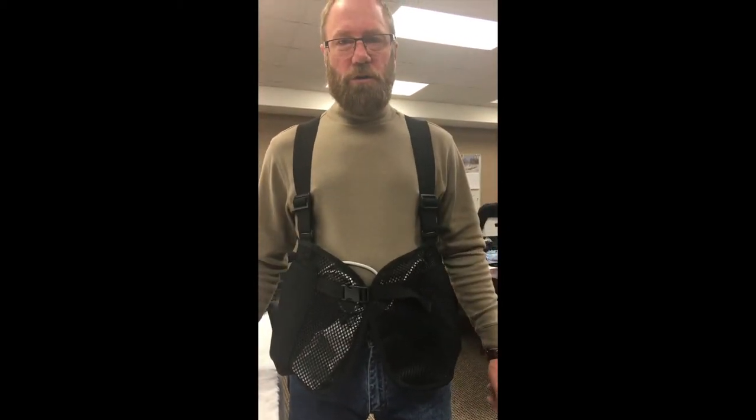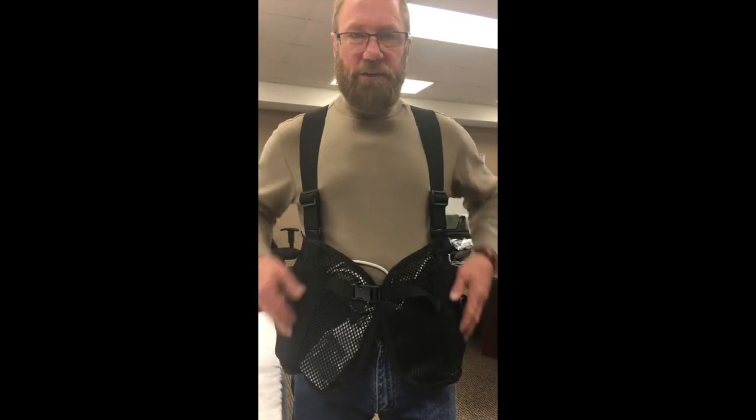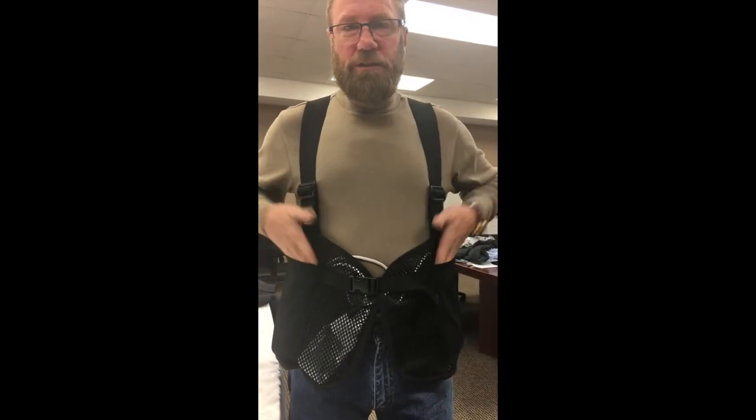They come in small through 3X, and you even have a little outside pocket for your keys or your cell phone.